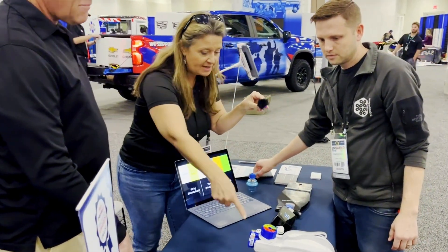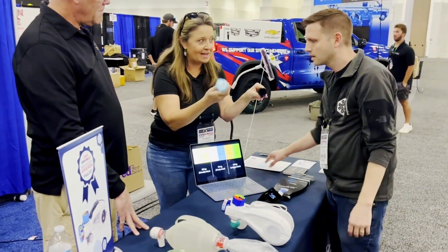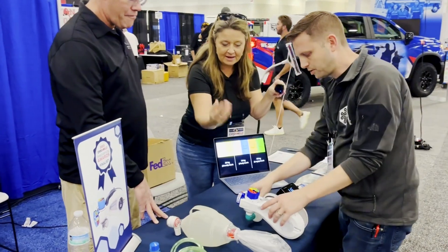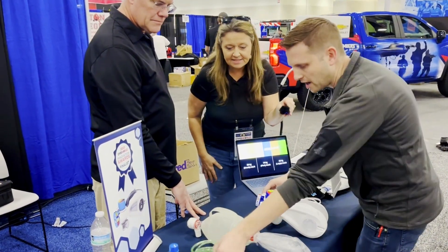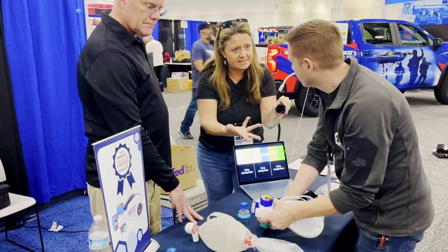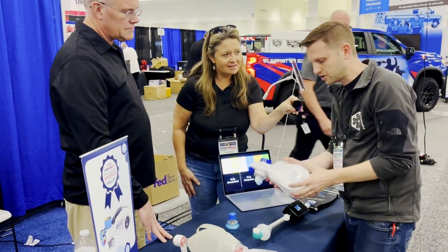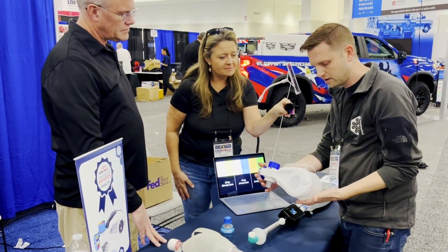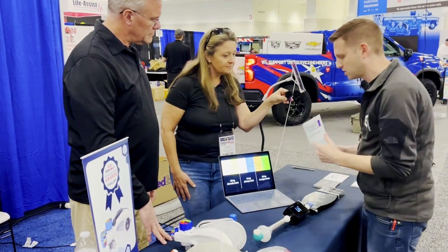Every single mask works with this — all the masks are compatible. In our lab, we were playing with adding PEEP using a standard PEEP valve, nothing fancy. Oxygen tubing goes in here, and the reservoir is interesting — it's built in internally. Because the valve opens more slowly, we don't need a reservoir hanging off the back.